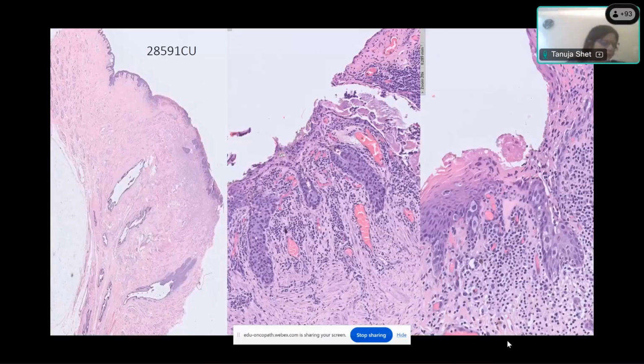So I need the resident's name. So right, just give me time. Since you all are not volunteering for cases, I'll have to pick one of you. Okay, so you can see this. Swara, do you want to go first and just describe what you see?